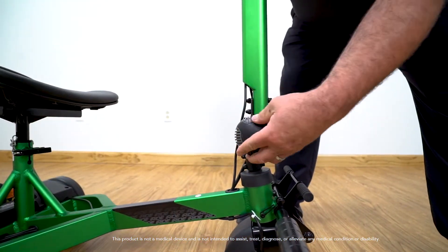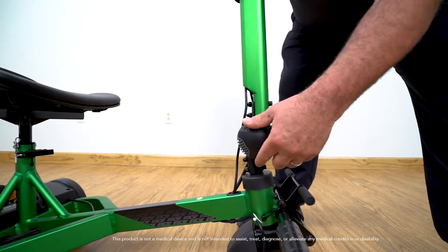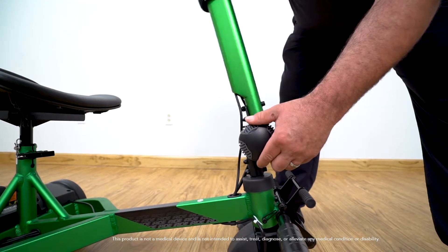To adjust the tiller, simply loosen the tiller adjustment knob, then lower or raise the tiller to its desired position.